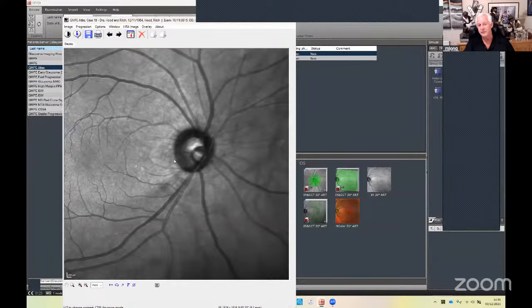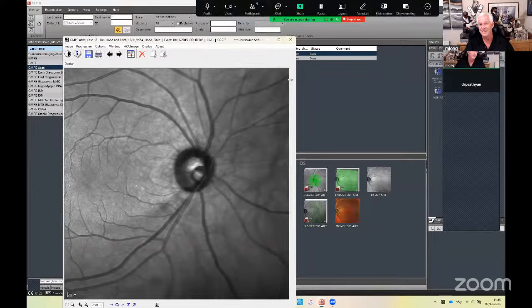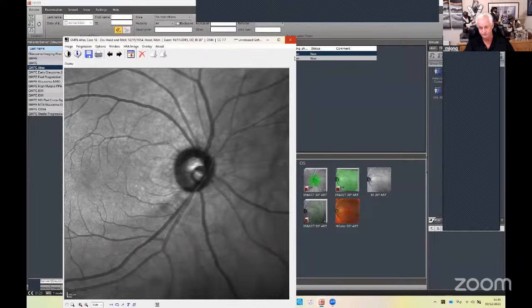Step one, I look at the neuroretinal rim. Step two, I look at the peripapillary nerve fiber layer. And then step three, we look at the whole of the macular area and the thickness of the macula. I'm particularly interested to look at the ganglion cell layer, because that's where we think the origins of problems start, and we might see early signs of damage there. And particularly we will see patterns of damage very early in non-glaucomatous optic neuropathies, even as early as 2 days to 2 weeks sometimes, if you catch the patient when they're having an event of optic neuritis, for example.